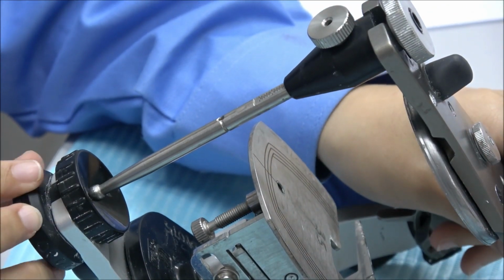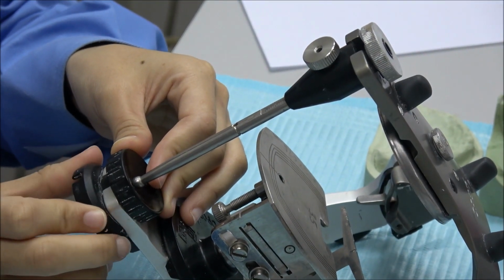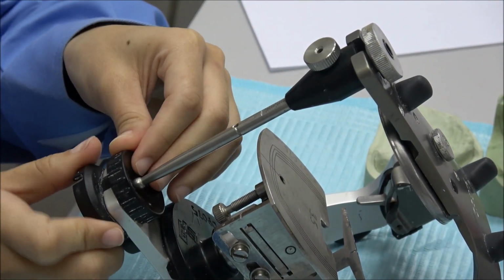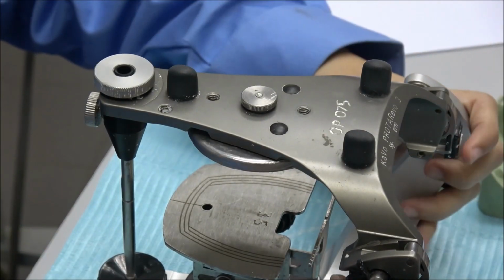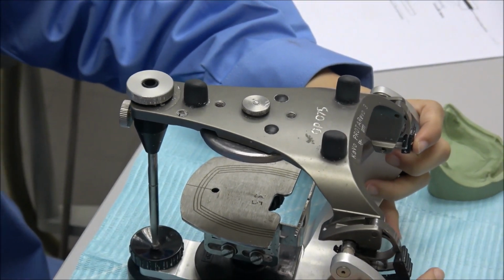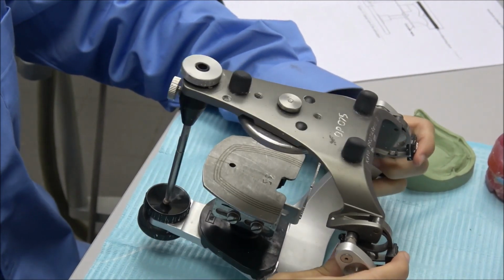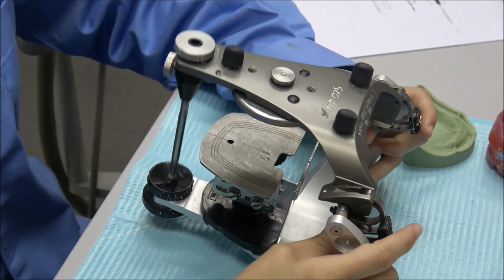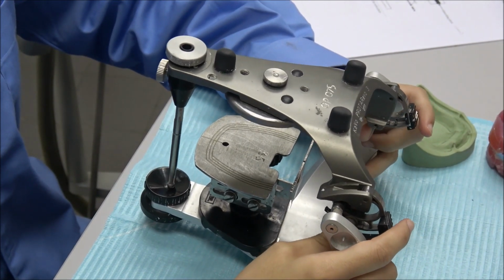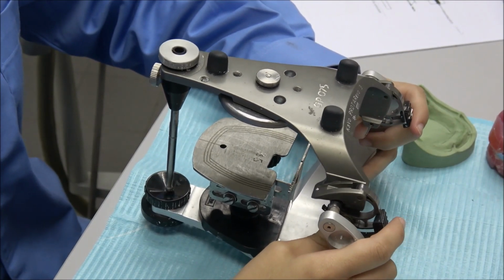This is our incisor table. We have to check because some of them maybe never locked properly. We have to check, make sure it's locked properly. And then here, we have to check here also. Here you can unlock, you just push it, and then to unlock, we can check our working balance. We will use it after resetting. When resetting, we will use it to make sure to do the working balance here.